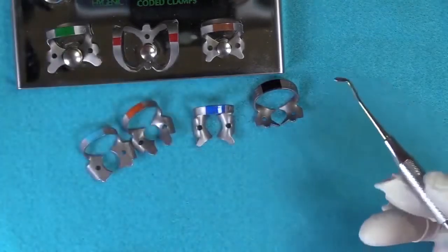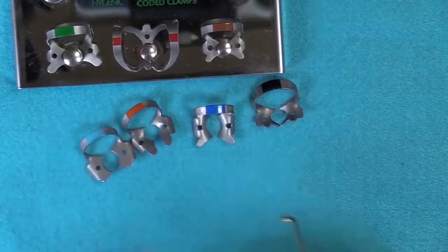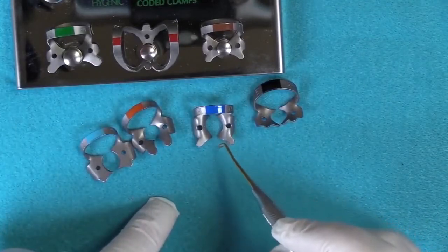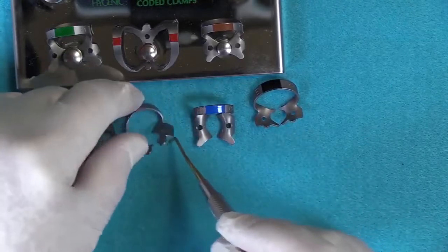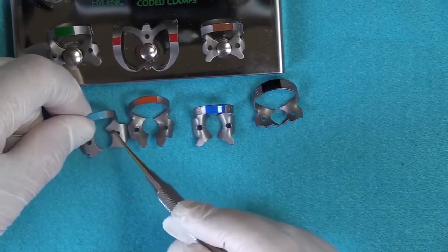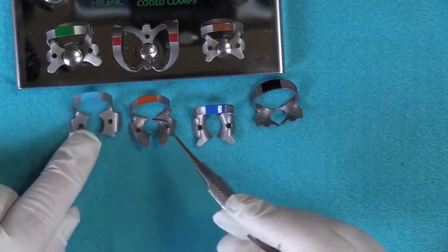Absolutely. So essentially, if you're looking at a tooth, you want to judge the size of it and imagine where the four points are going to be contacting the tooth surface, and then you select a clamp that'll accommodate that size. You just determine it by looking at the mesial to distal width. As you can see, the number 4, for example, is a little bit smaller than the 7, and you see how this is a greater distance there. So your 7 can be used on a larger molar.